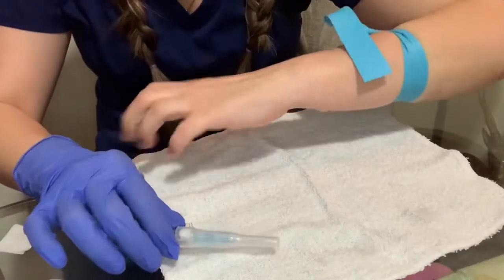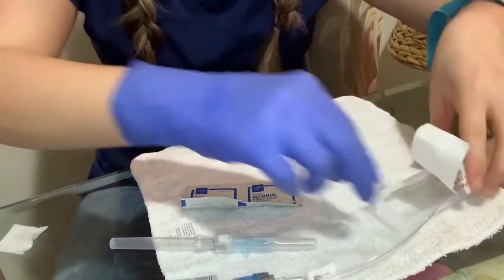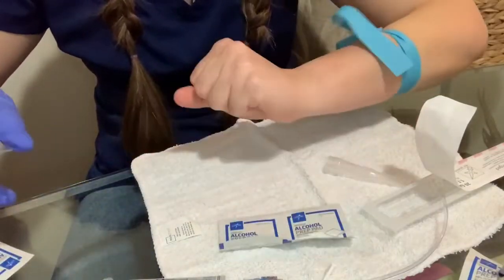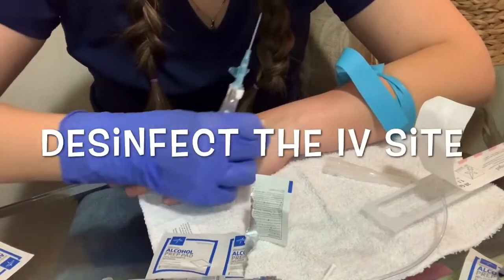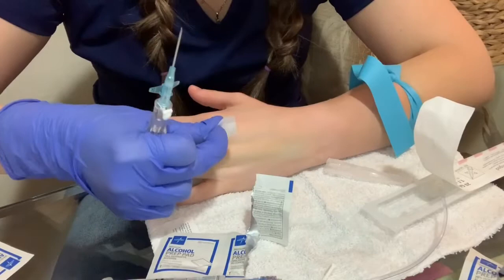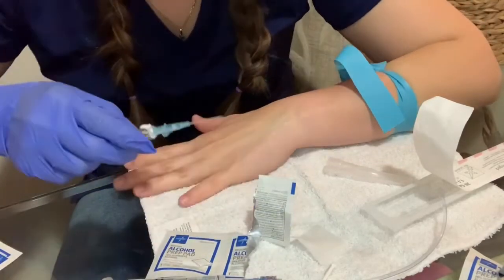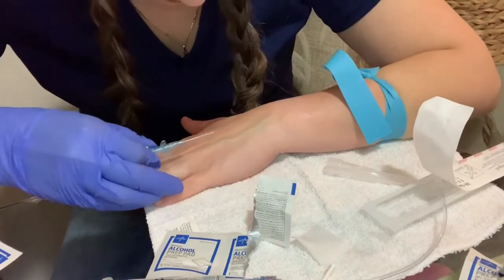Some steps you have to follow: always verify the physician order, identify your patient with two identifiers — the full name and date of birth — and explain the procedure to your patient. Position the patient in a reclining or semi-Fowler's position, and start looking for a good vein. Feel those veins.